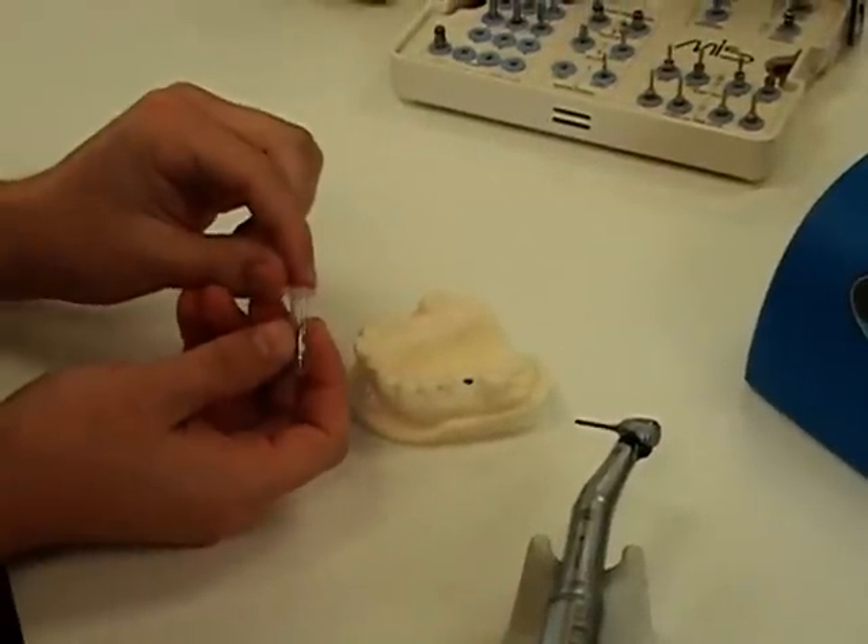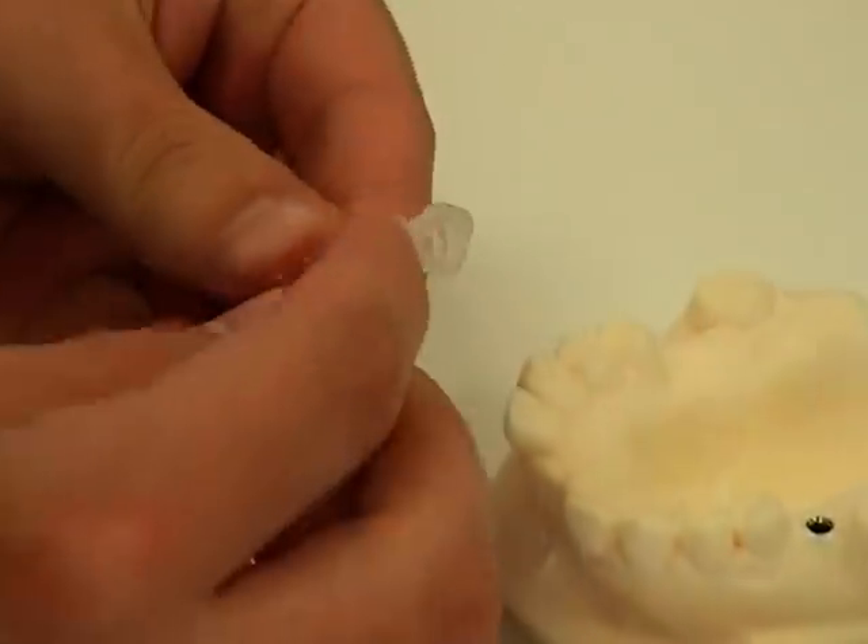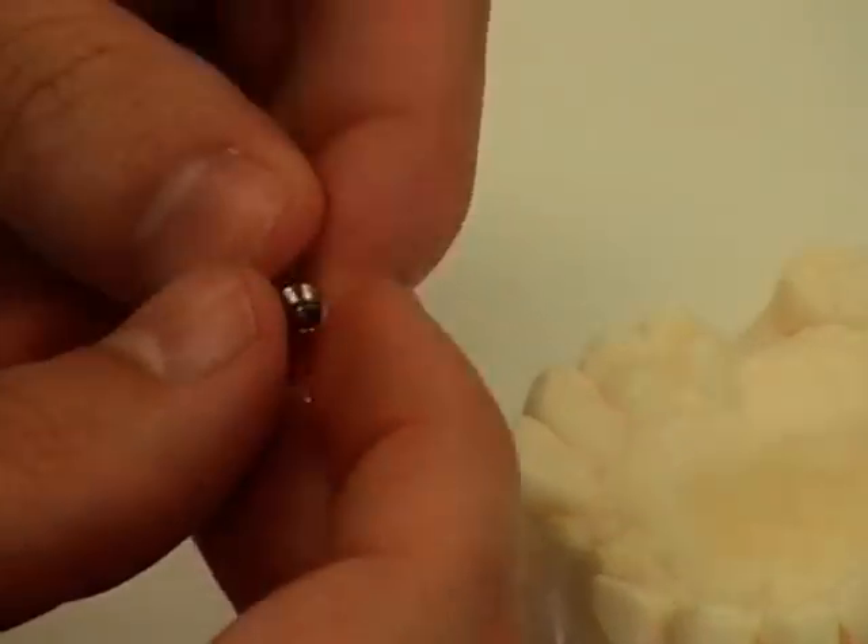We have our abutment, MD-MAC10, a straight titanium abutment, which we're going to place. Note that the screw is already there.